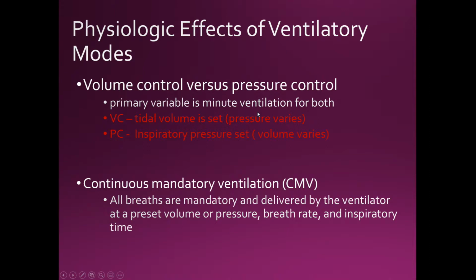So when we look at the differences of volume control and pressure control, I'm going to reiterate this. When you're on volume control, you set the tidal volume, but the pressure varies. And when you're on pressure control, your pressure is set and your volume varies.